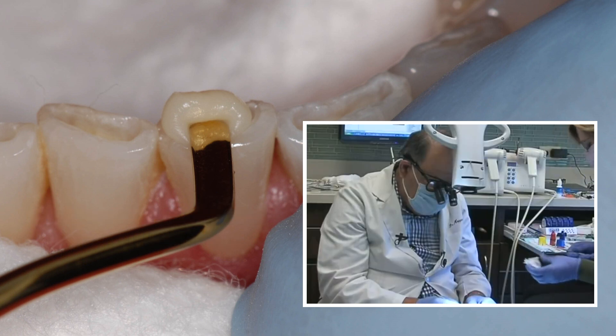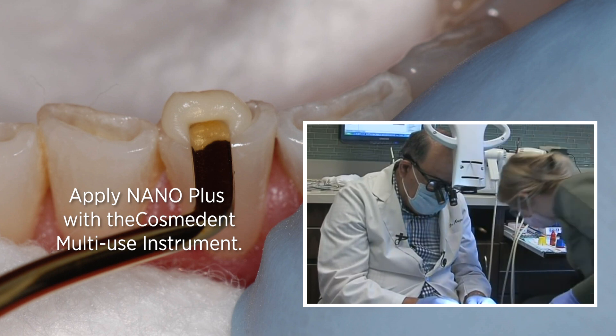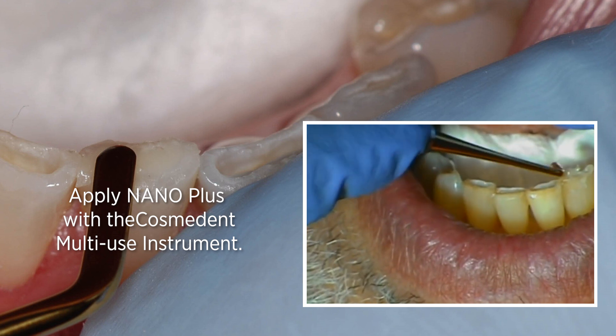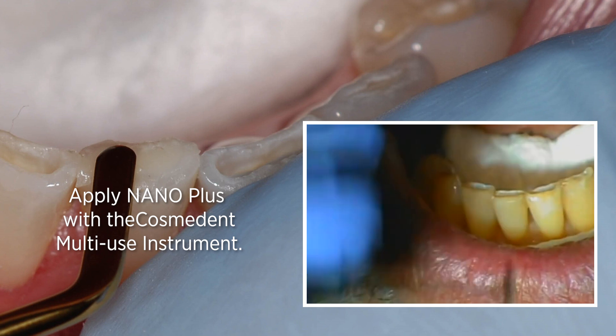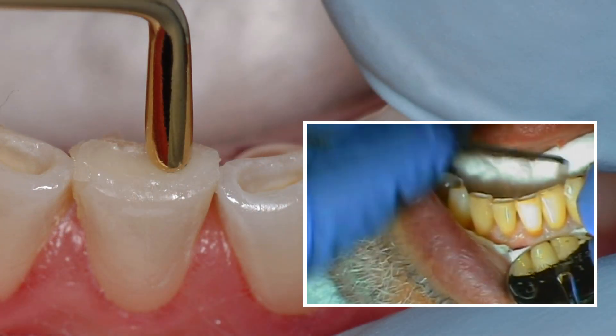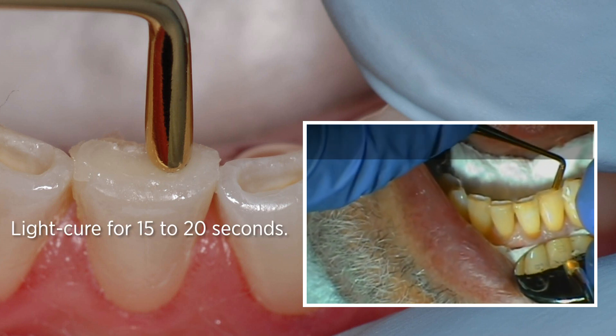What we're doing is putting in the dentin reinforcement, which is the nano. And I'm going to indent that — in other words, make it concave — so that my final surface is the Microshell, because I'm going to get the best wear with Microshell.